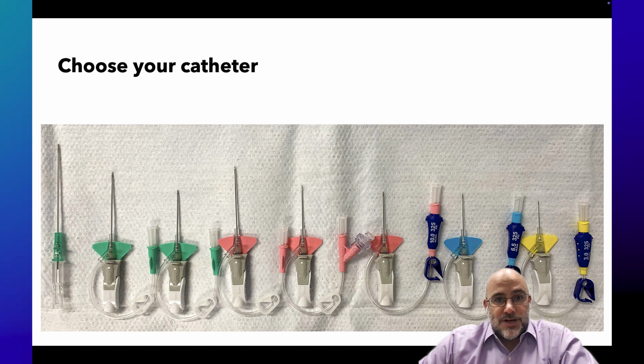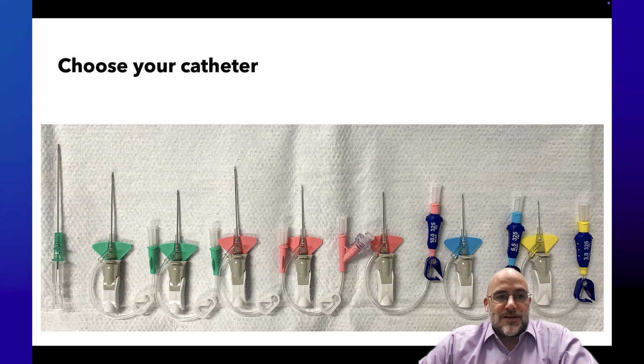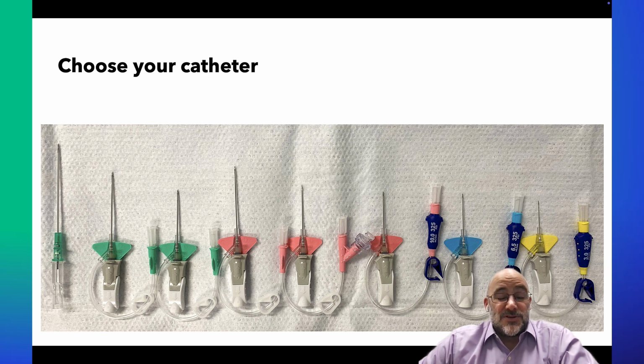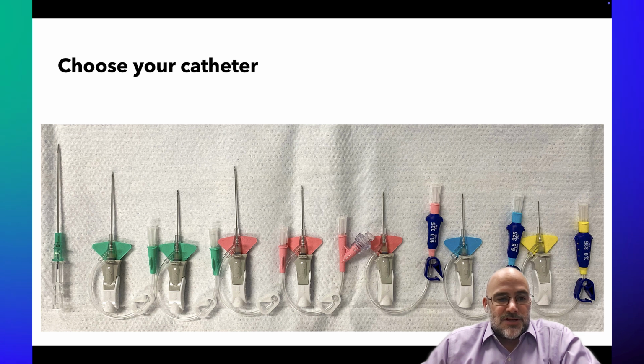However, if you've got a patient where you can't get access, and so you've come to an ultrasound-guided IV, I would suggest thinking about whether an ultrasound-guided IV is the best choice, because you are going to need a long catheter to get to those deeper vessels, and maybe a different access is required if you really need to put in that volume. Maybe that patient needs that introducer gauge type access because of their volume flow rate requirements.